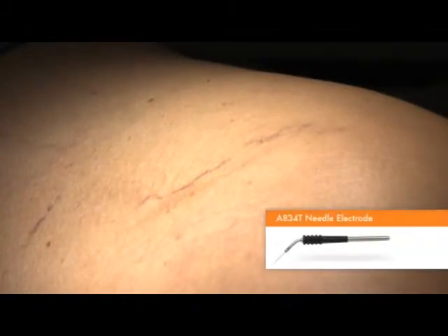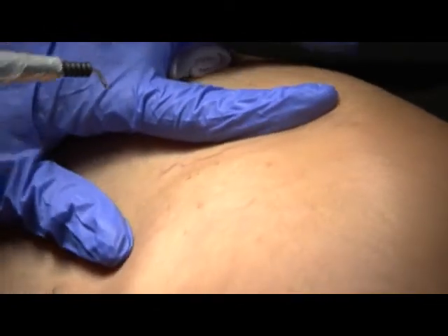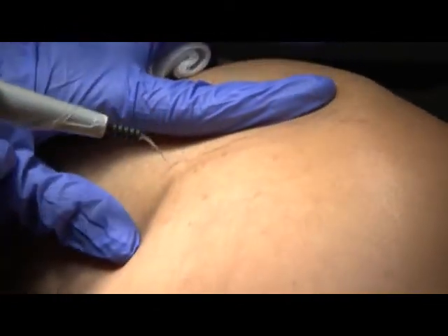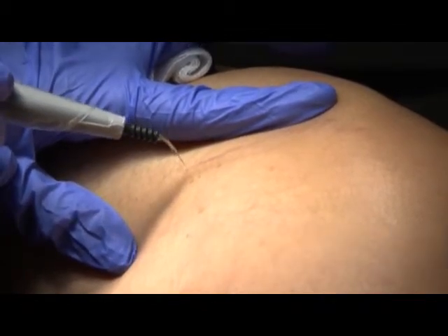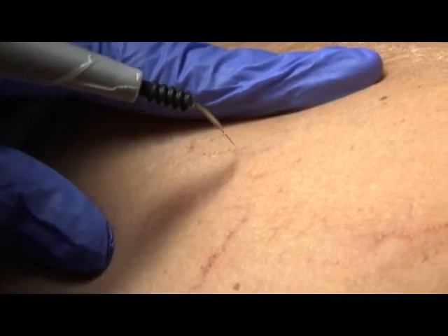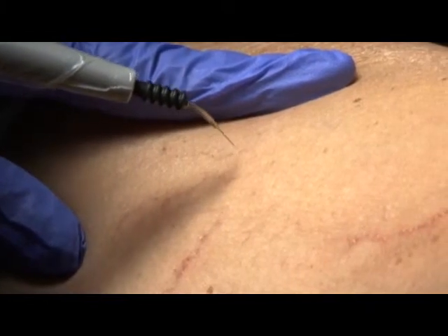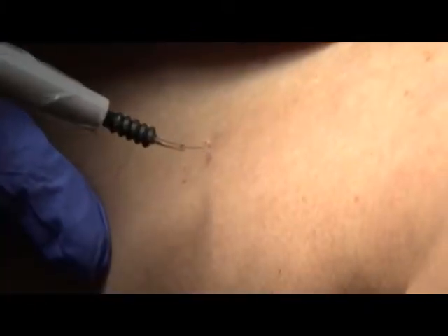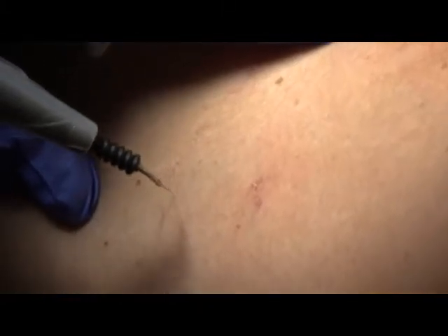The A834T needle electrode or similar fine point electrode works well for removing small telangiectasias. We use no anesthesia, as doing so would temporarily obliterate the blood vessel we are treating. Using a power setting of 0 to 3 watts, apply current directly to the vessel for a fraction of a second. With the proper power setting, the vessel will immediately disappear with minimal damage. The ARIN 940 offers power output control down to 1 tenth of a watt, also making it ideal for facial telangiectasias. It is easy to make accurate minor adjustments and minimize potential scarring.